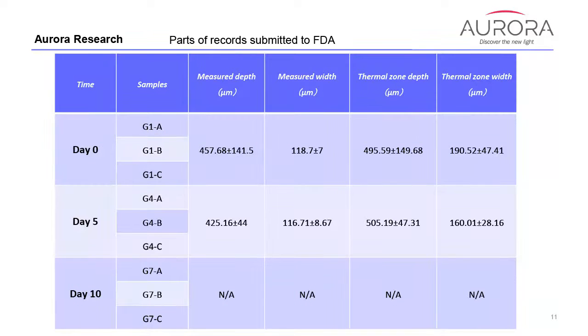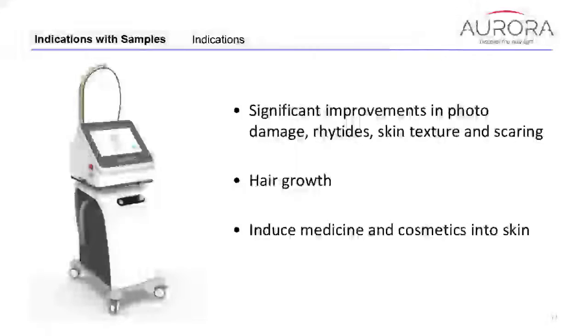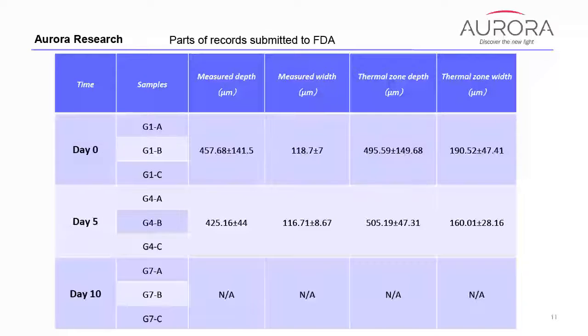From this data, you can see the thermal injury depth reaches 500 μm, and the width reaches 200 μm. After 10 days, there's no thermal injury that could be seen. The skin restored very well. This was done by our first demo machine, so we plan to do the second experiment with our standard parameters now.